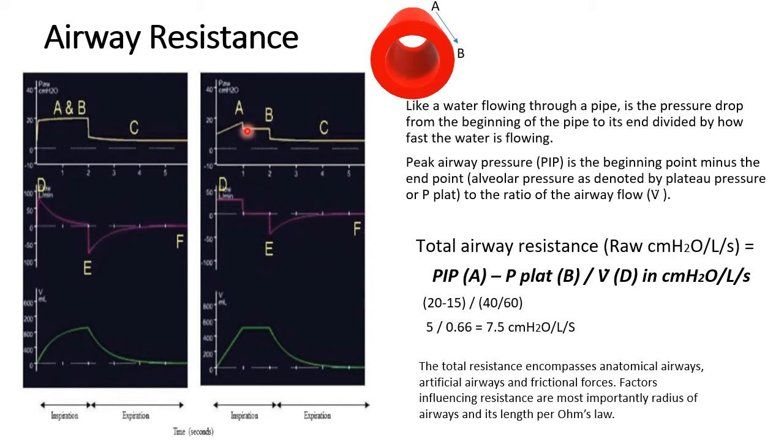We put in an inspiratory pause here. So if you notice, the airway pressure goes up, peak inspiratory pressure, we put the pause. The pause has to be long enough. This is a little bit short. It has to be at least 3 seconds. And you notice the drop, and that drop is because there is no flow, so there is no resistance.